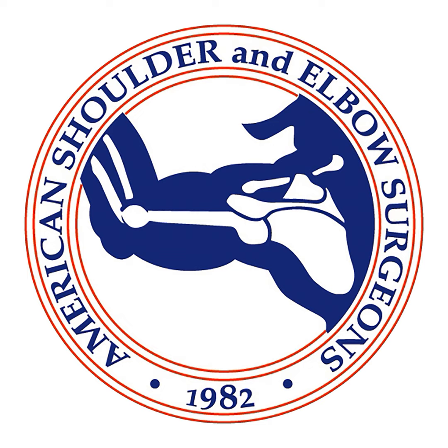Can I follow up with you on that, Mike? I just want to make sure I understand. So you would say that for you, the bioinductive or the thin patch, maybe we just label it the thin patch for now, is something you really only use if you can get the tendon all the way laterally back to the lateral edge of the footprint, and you can get a nice double repair, then you put the patch over the top. Yes, for the most part, yes.